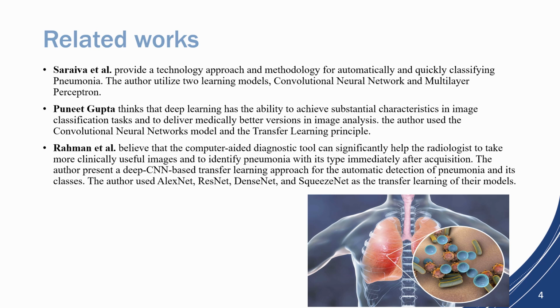Punit Gupta thinks that deep learning has the ability to achieve substantial characteristics in image classification tasks and to deliver medically better versions in image analysis. The author used the convolutional neural networks model and transfer learning principle.